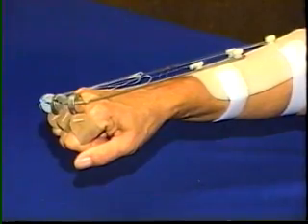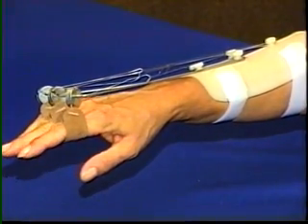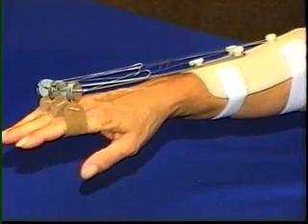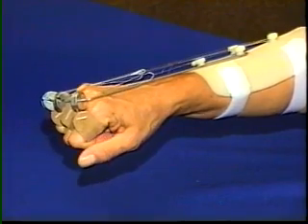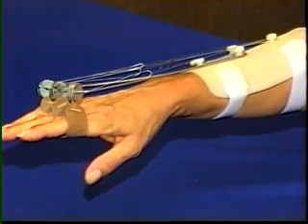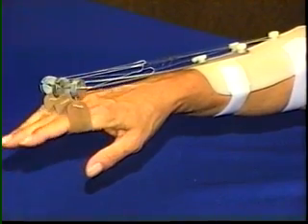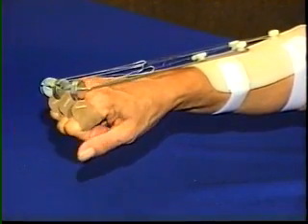It is not usually necessary to support the thumb in an outrigger. The wrist cannot move into extreme flexion to overstretch the thumb extensors and abductors. The median nerve innervated intrinsic muscles of the thumb partially or fully extend the interphalangeal joint, and the wrist motion will pull the thumb away from the palm.